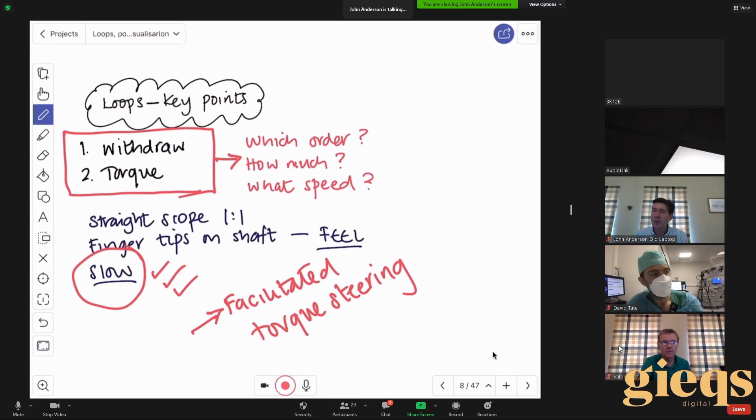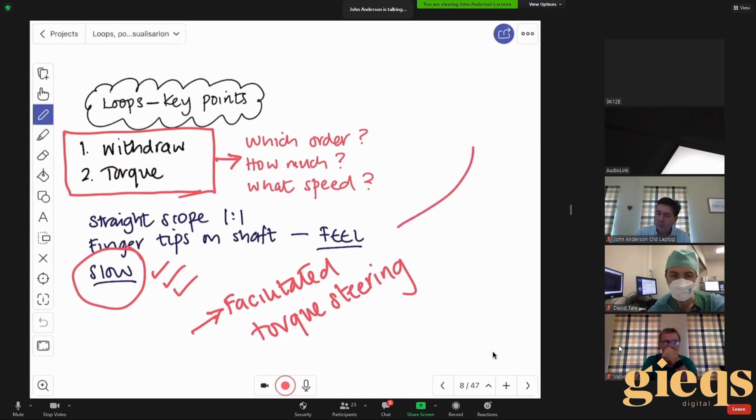In addition to torque you've also got to be able to control the tip and maneuver it to maintain your luminal view and stop yourself crashing into folds of the mucosa, which add resistance and cause loops to reform. As you negotiate around the colon and straighten the loops out you end up with a question mark shape, and that means when you push in you naturally go in one-to-one — at that point it's predominantly tip steering. But it isn't one or the other — we use them both together.